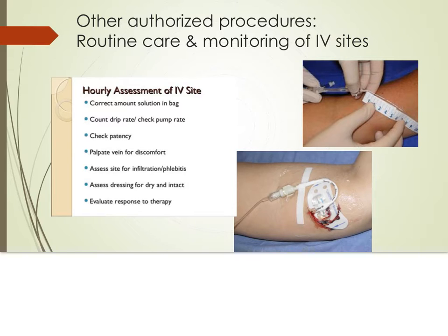The nurse should verify that the solution is hanging, that the amount infused is correct, and that the rate is correct. The nurse should assess the IV site, checking for patency, palpating the vein for discomfort, and assessing the site for signs of infection, infiltration, and phlebitis.